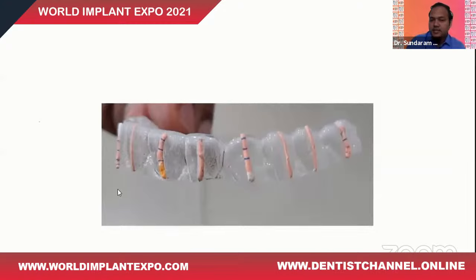For instance, the simplest one is the GP points, or gutta percha points, that you can see placed in the vertical grooves on the wafers. Once this is done, I send the patient for the CBCT. The patient is supposed to wear these and then sit for the CBCT.